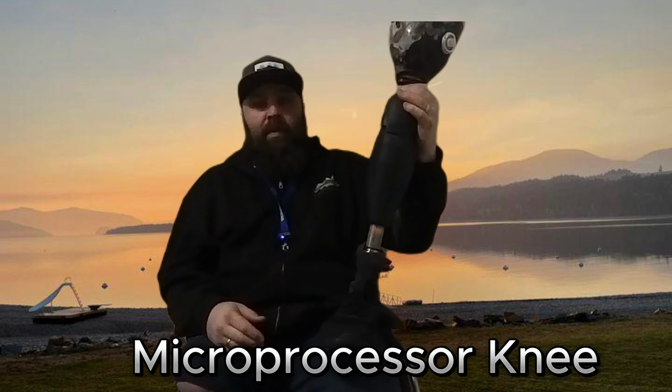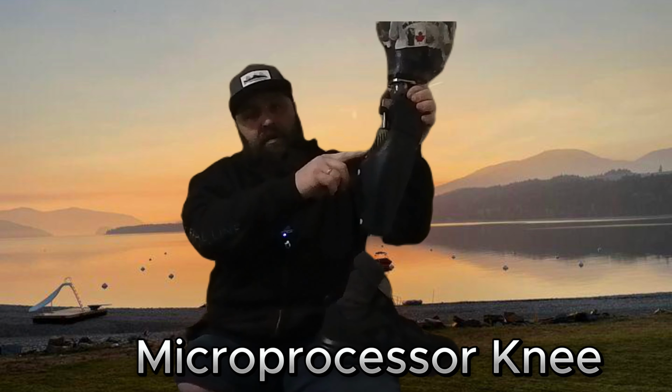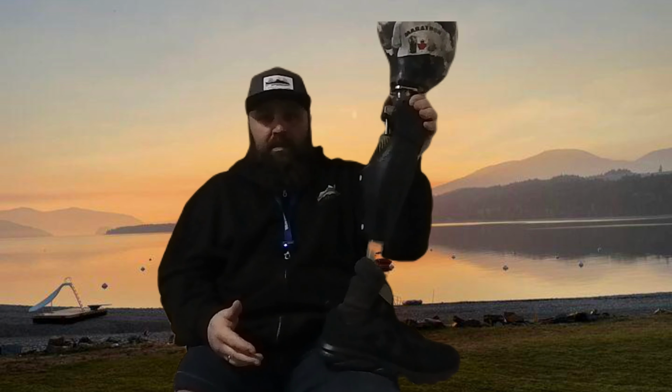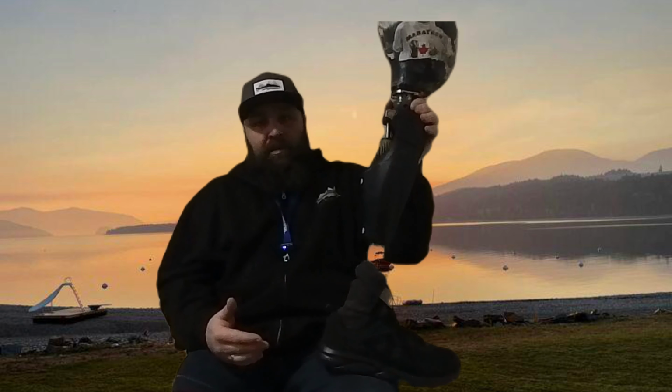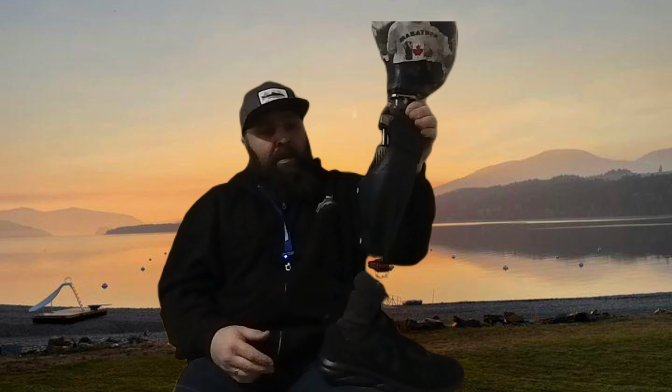It makes it easier. Well, all it does inside is it's got hydraulics. What the hydraulics do is they release the fluid, so the faster you release the fluid, the faster the knee is going to go. It also has computer sensors. So when you're going down hills, I call it riding, you sit on the knee and you ride it down. It slows the pressure down, makes the knee break a lot slower. This knee is phenomenal.